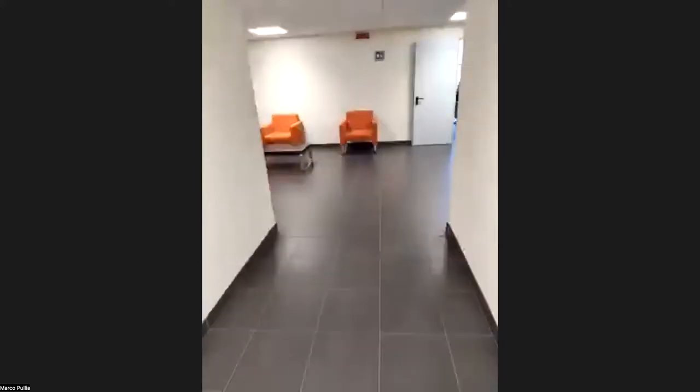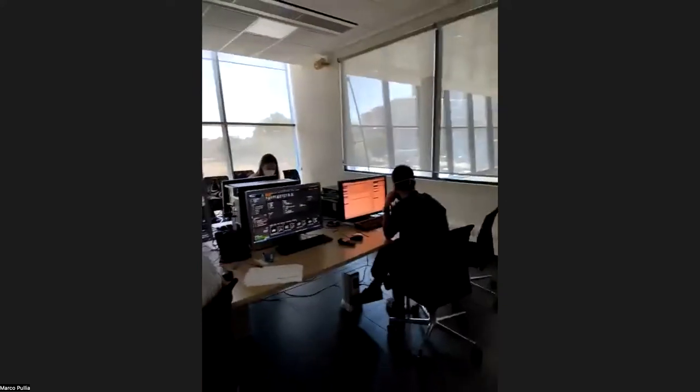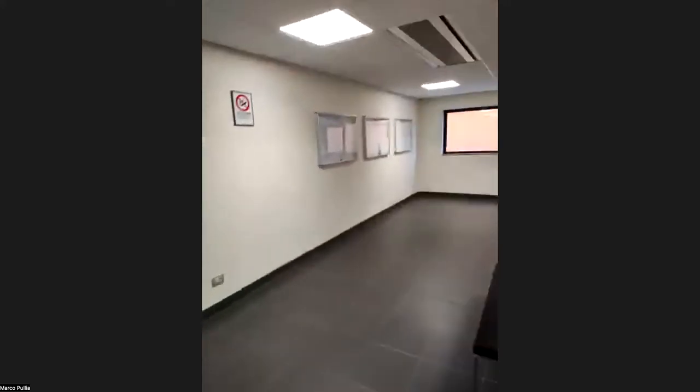Offices on the left and on the right. Treatment planning room. With treatment plans on the screens. Regards from the HITR school. And now an even more exciting staircase.